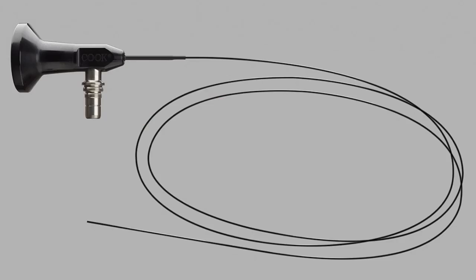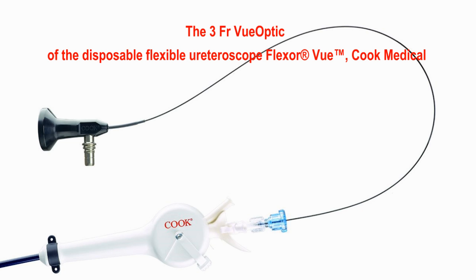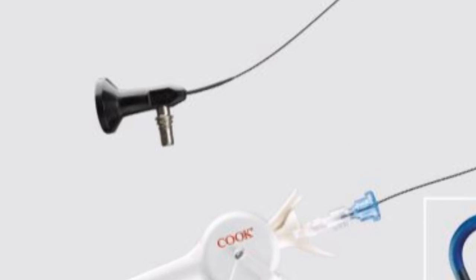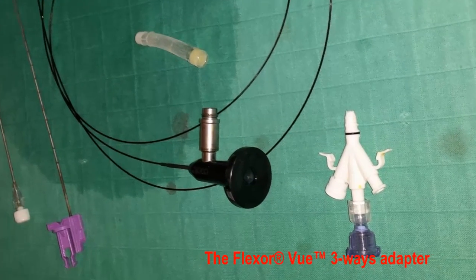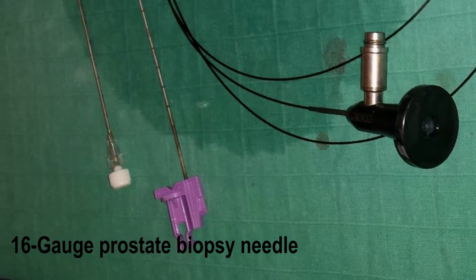We used the Cook Medical ViewOptic, which is the visualization source fiber of their disposable flexible ureteroscope, along with a three-way adapter and a 16 gauge prostate biopsy needle.